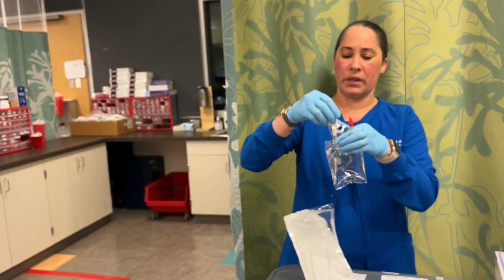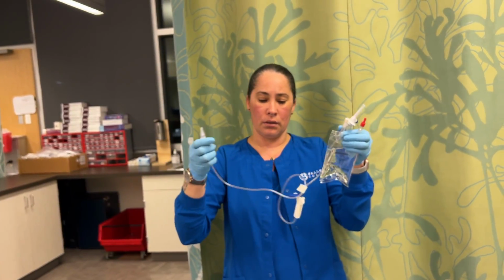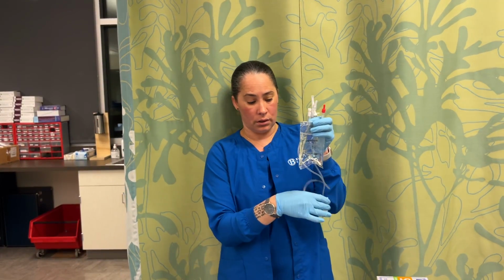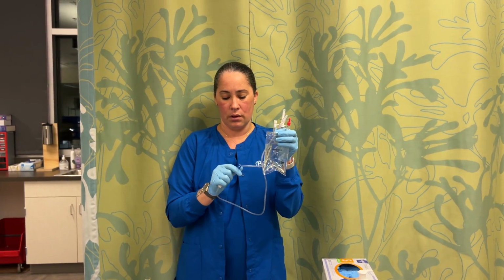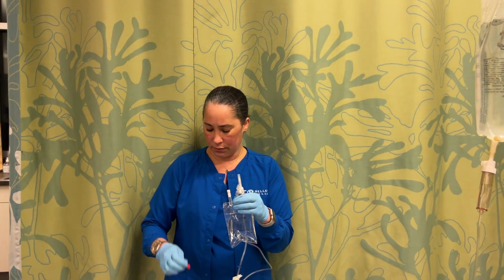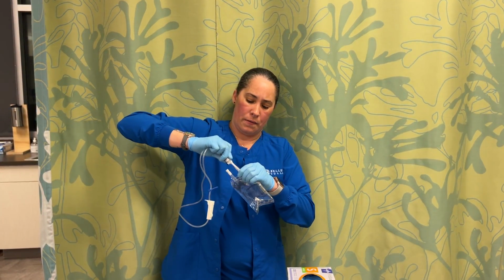Same thing with this. You want to make sure that the ends are not touching anything. Same idea with this one. Goes here. This one goes to the port. Move that. Again, you're going to clamp. This one has a couple clamps on it too. Just do both. Better safe than sorry. All right, so clamp. And we're going to take this off, and we're going to take this off, and we are going to puncture our bag.